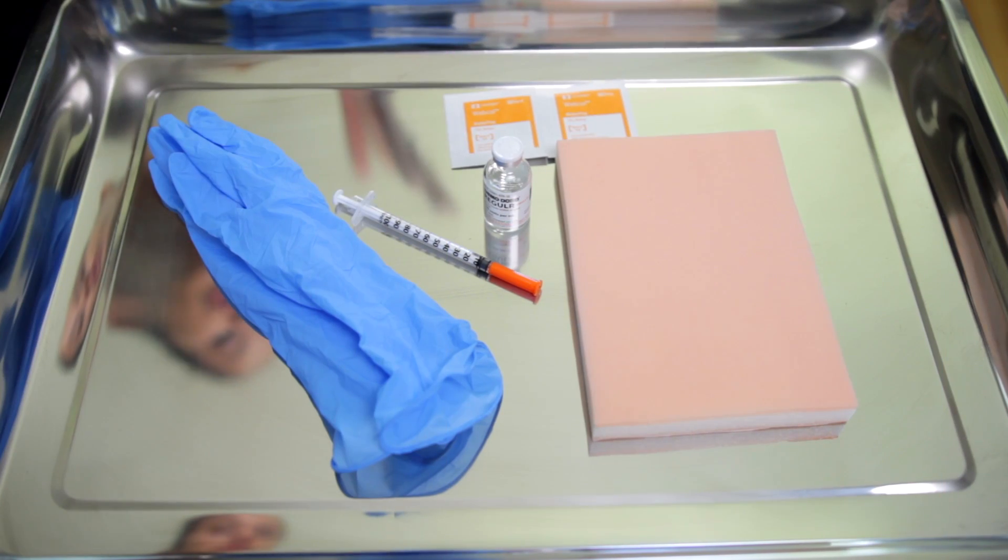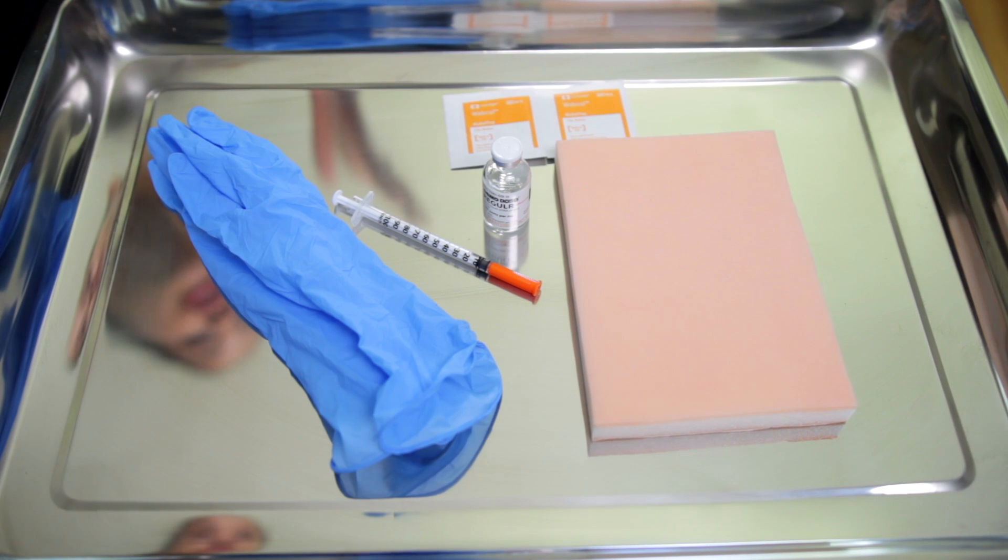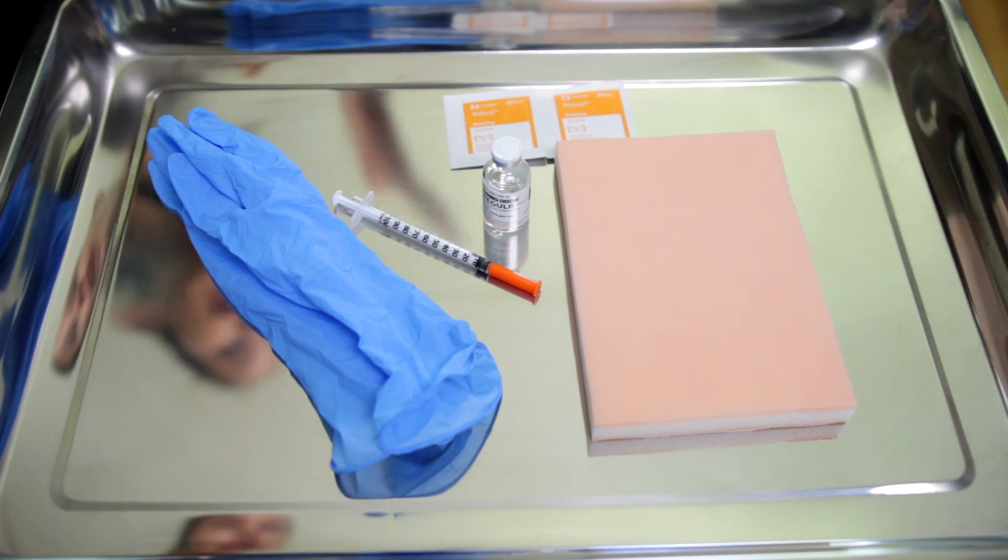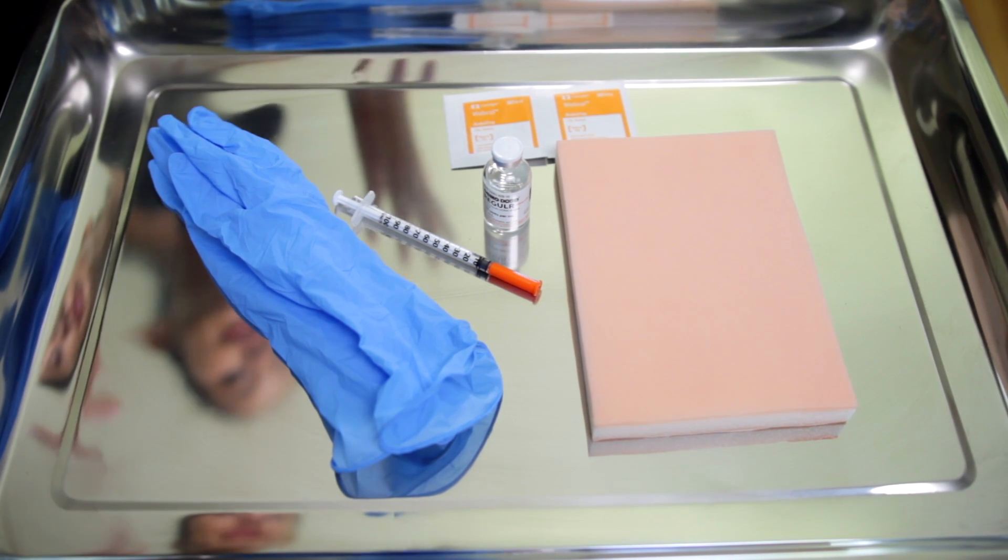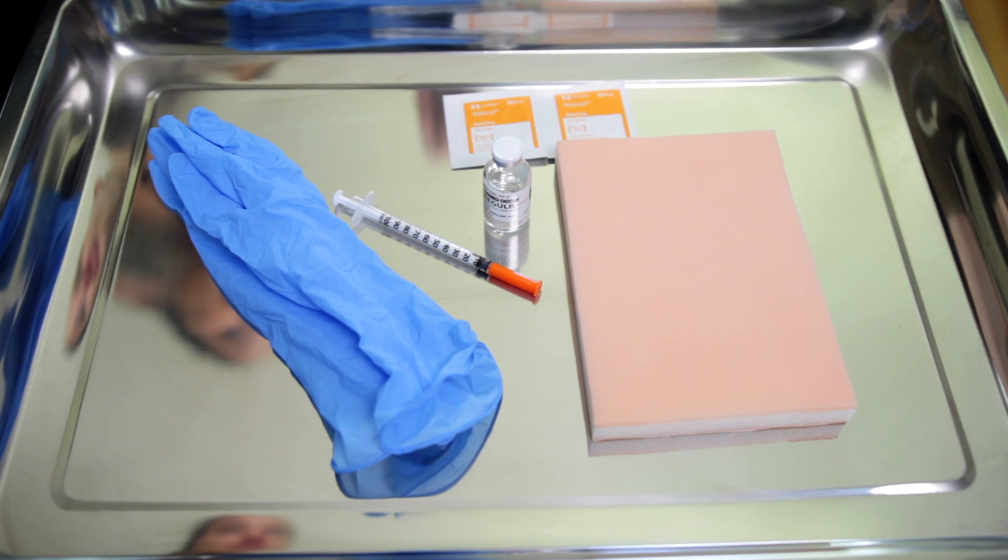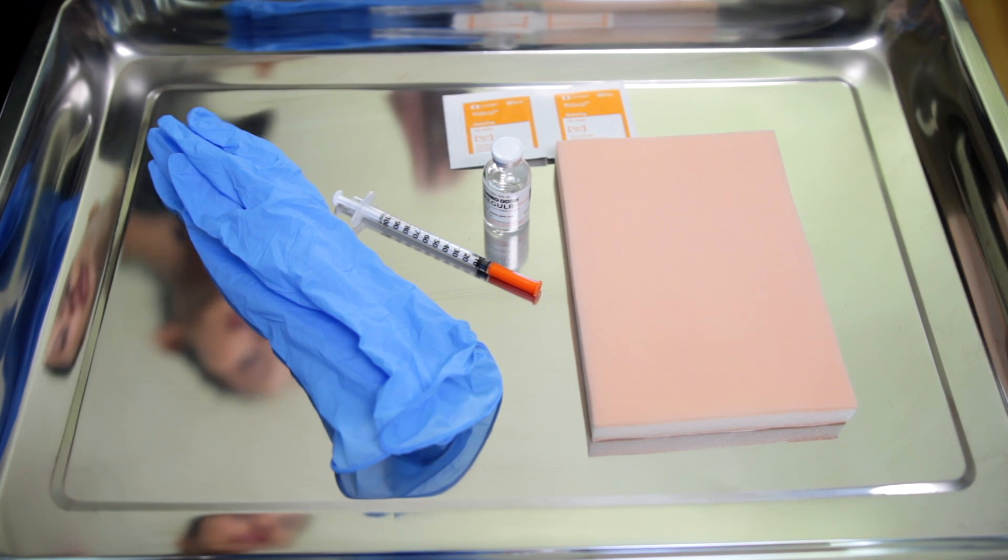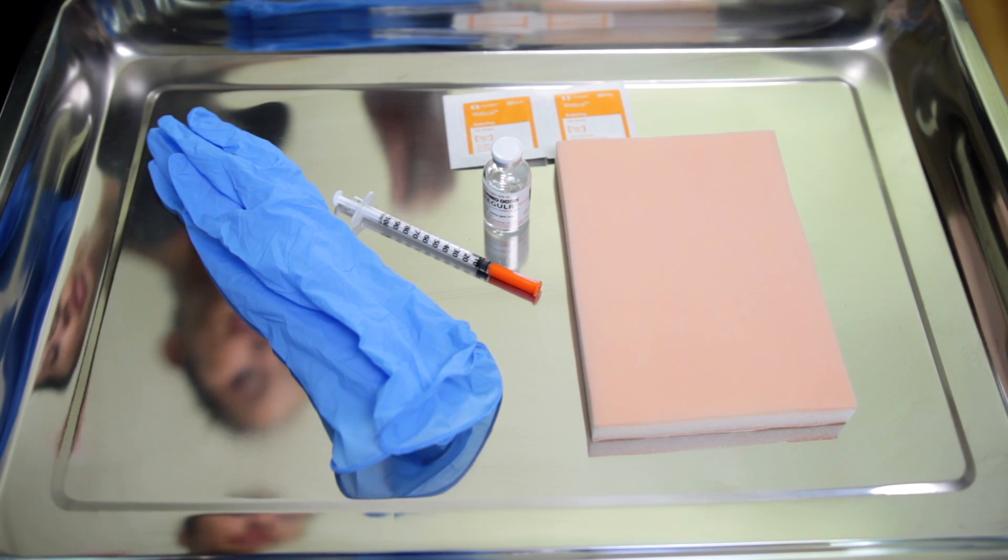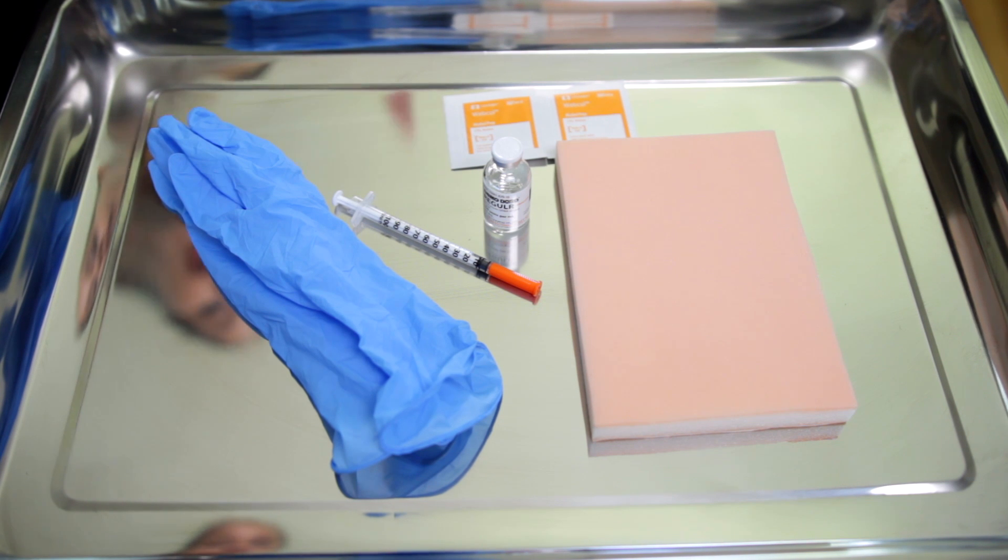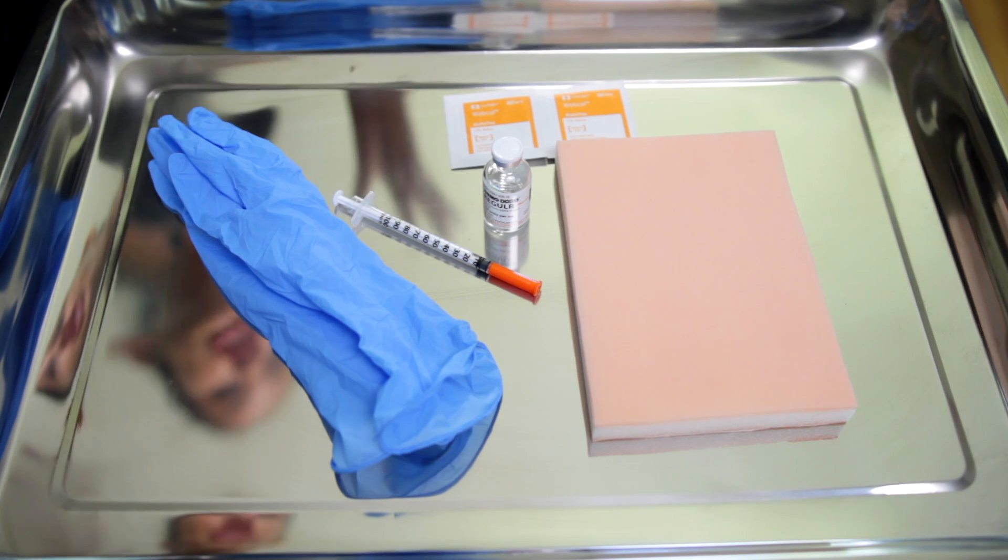So it all starts off with a blood sugar that is elevated. You are going to follow your standard protocol guidelines. You will have a sliding scale. So let's say the blood sugar was 141, so the patient needs about three units of insulin. You're going to gather your supplies, do your hand hygiene and check all your medication rights.